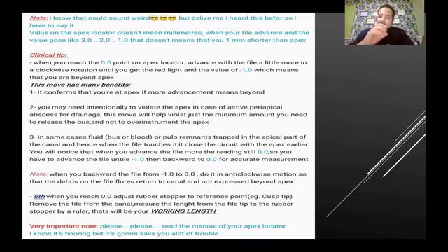In some cases, another thing that is very interesting and happened with me in many cases, is that there is a drop of fluid at the end of the canal. The canal is empty, or has drops of water not connected with each other, and there is a drop at the apex. When the file touches the beginning of this drop, it will close the circuit and give you 0.0. If you touch this drop of water or irrigant that fills 2 or 3 millimeters of the canal, when you touch the first part of this water bubble, it will give you as if you are in the apex.